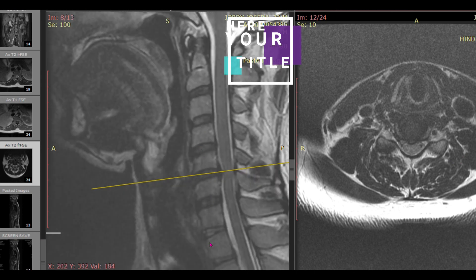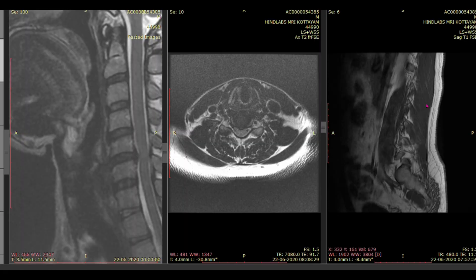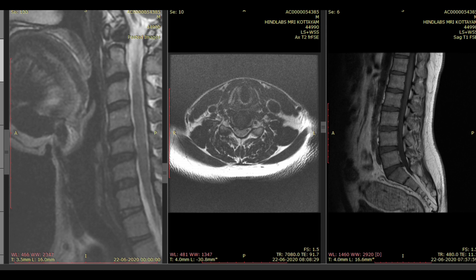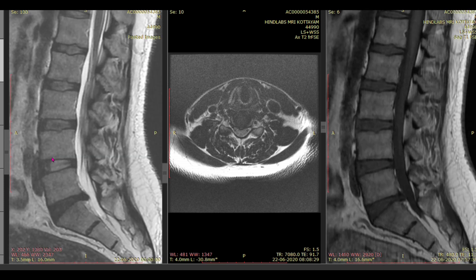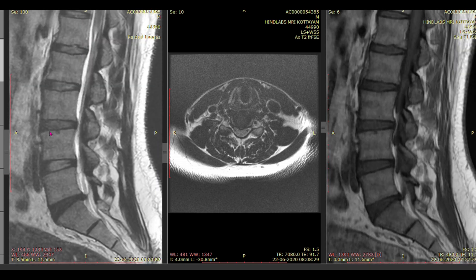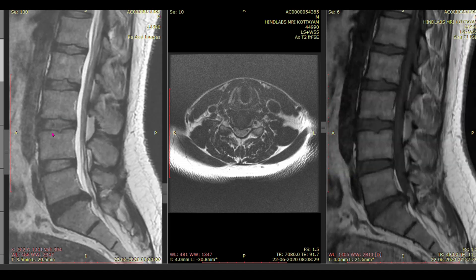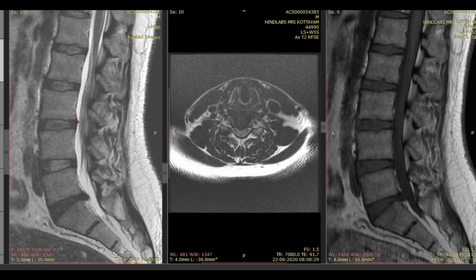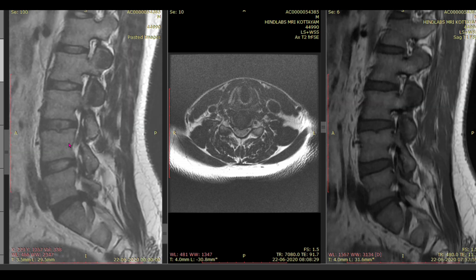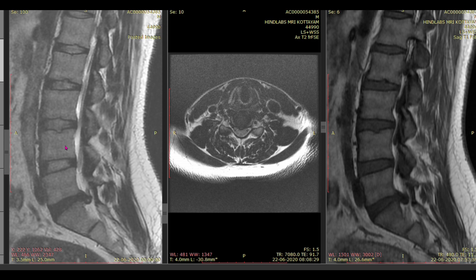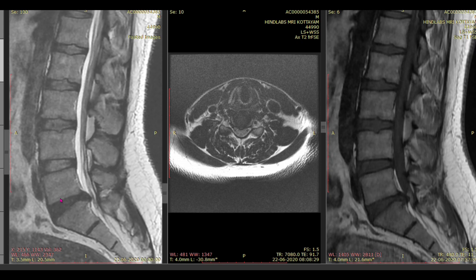Coming to the discs: the normal signal of the central portion of the disc will be bright on T2-weighted images and of intermediate signal on T1-weighted images. This central portion corresponds to the nucleus pulposus, which is a loose cartilage-like material with a lot of fluid in it. Surrounding it is a dark signal area corresponding to the annulus fibrosus, a fibrous ring surrounding the nucleus pulposus that prevents it from herniating and provides support.